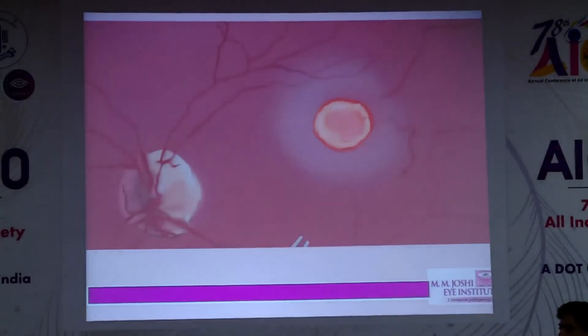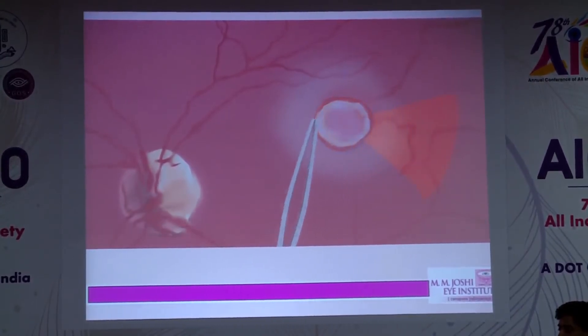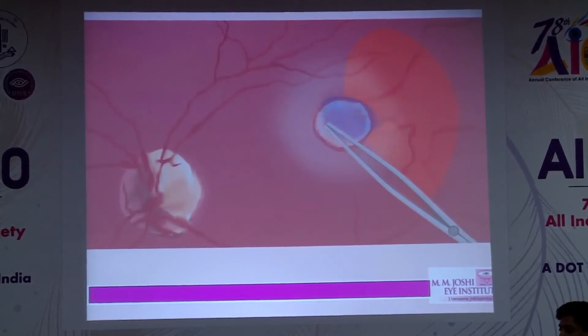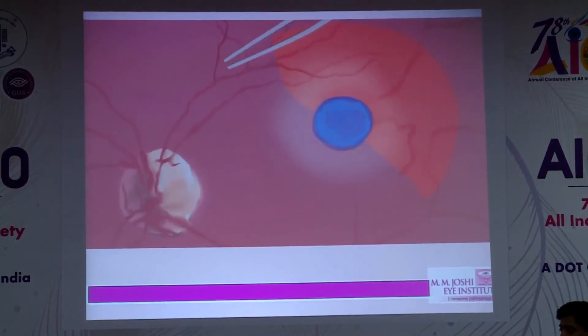I would like to show the first animation about the multilayered flap technique. Instead of taking everything as a whole and bringing it as a hinge, I try to take it in a petaloid fashion one by one, so that the advantage of this technique is — even if one flap goes off, the rest of the flaps still remain.